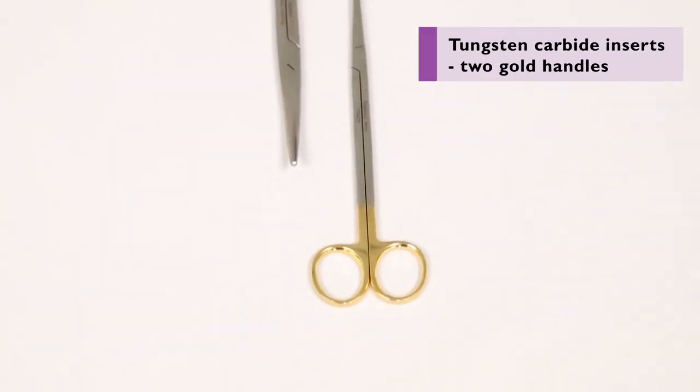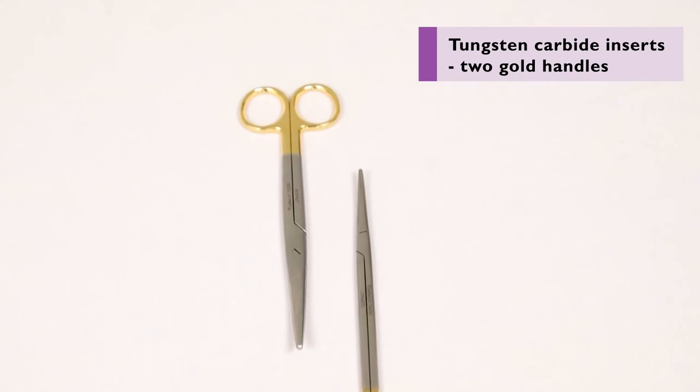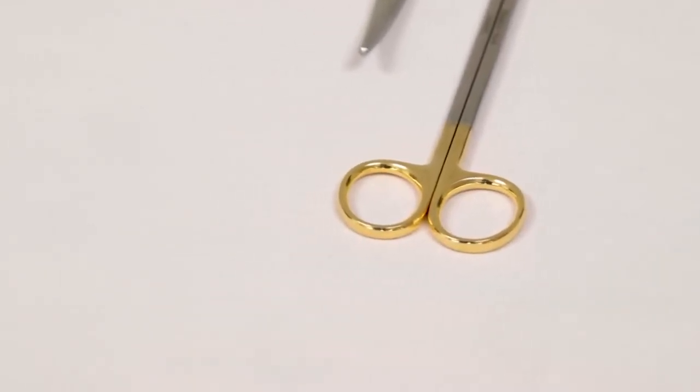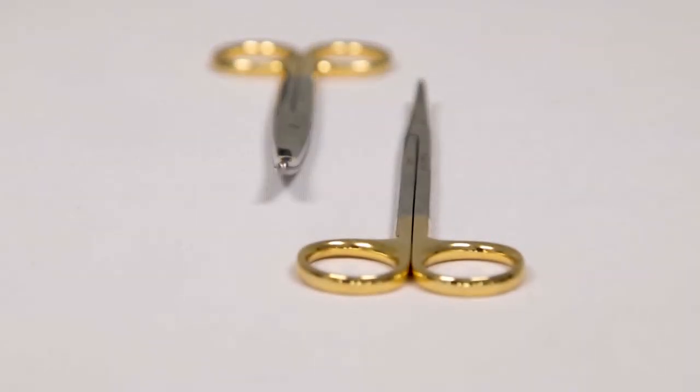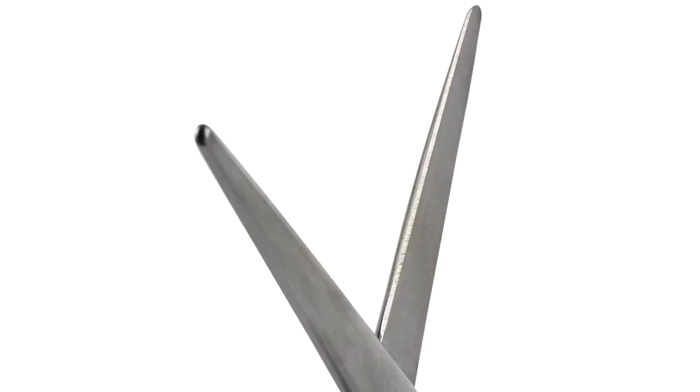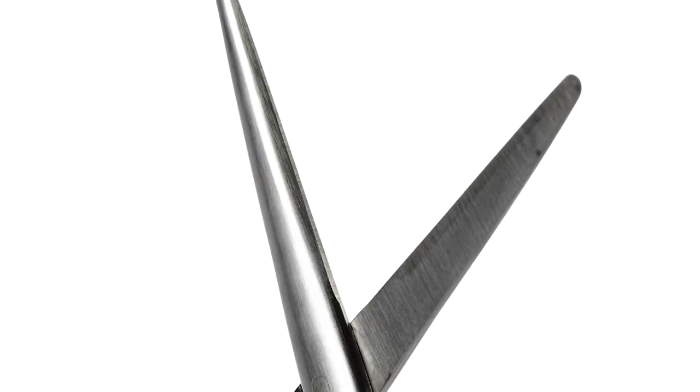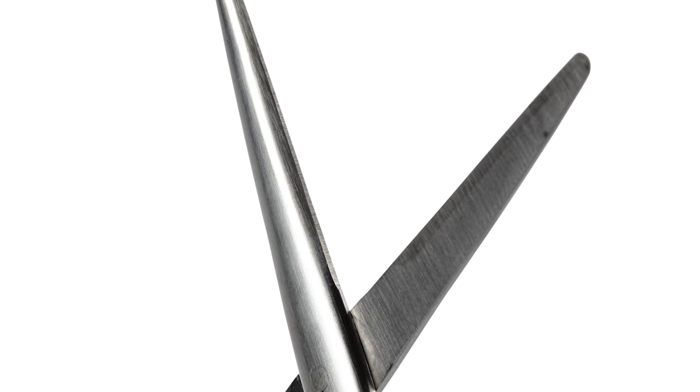Two gold handles indicate tungsten carbide blade inserts. Tungsten carbide is a strong, hard-wearing material, considered a superior choice by many surgeons. The inserts are designed to enhance the working life of the scissors and may lengthen the time required between sharpening.